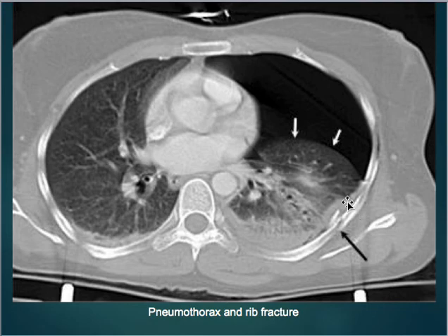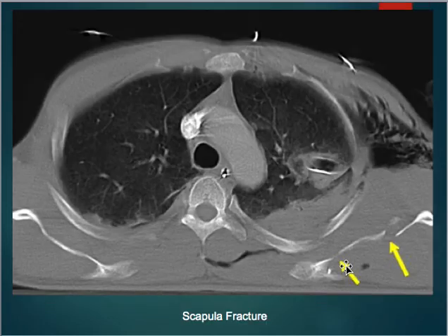This one, oh, I forgot, this one actually has a rib fracture too. You can kind of see right here. So this is probably what caused that pneumothorax. Patients can either have spontaneous pneumothorax, which there really isn't an underlying cause, it just happens all of a sudden, or it can be caused by an injury like a rib fracture, where it causes the lung to collapse.